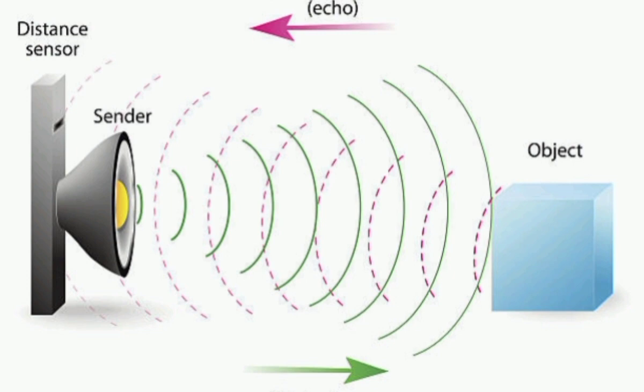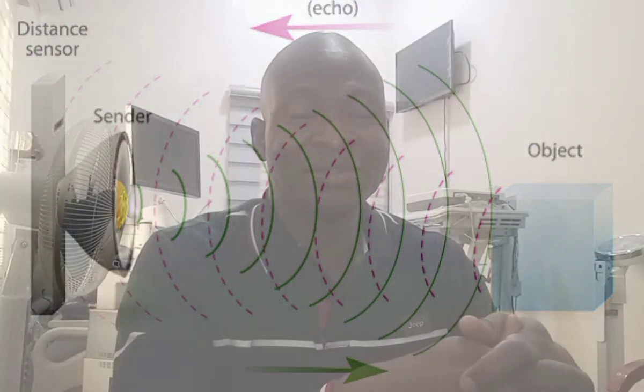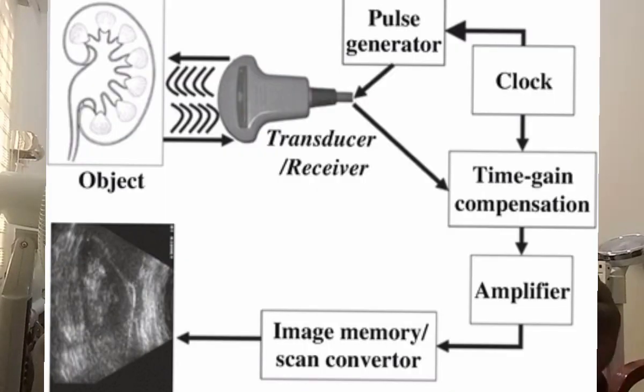Now, the transducer converts the returning echo into electrical signals, which we call RF signals. Each RF signal is then digitized and amplified, and further electronically processed. Basically, what happens in the electronic processing is compression, demodulation, and rejection, with other things we'll get into shortly.